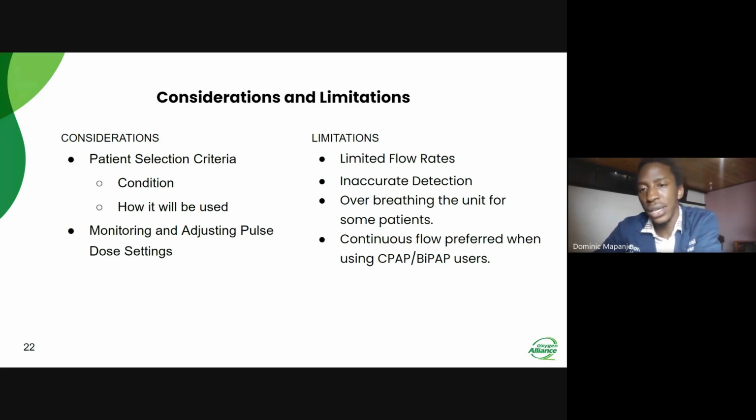And there are also cases of inaccurate detection of breaths, that is during sleep, or when you are breathing through your mouth. And also there have been issues of inaccurate detection of inhalation and exhalation during activities when your breaths change in their pattern.